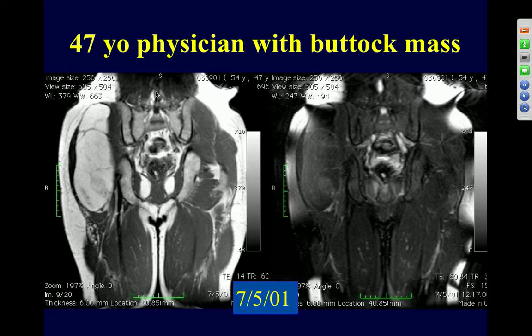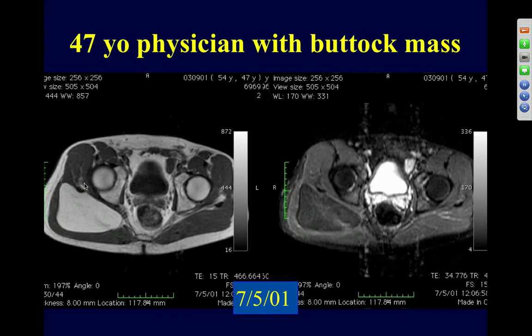Here's a 47-year-old physician who had a large buttock mass, which you can see here. Suppresses with fat suppression. Again, it's a lot of inhomogeneous signal intensity, so this could not be put in the benign category. This is one that you'd have to be concerned about. Axial images still, it's mostly lipid, but there is other signal intensity in it, but certainly this doesn't look as bad as some of the other benign lesions that we talked about earlier.